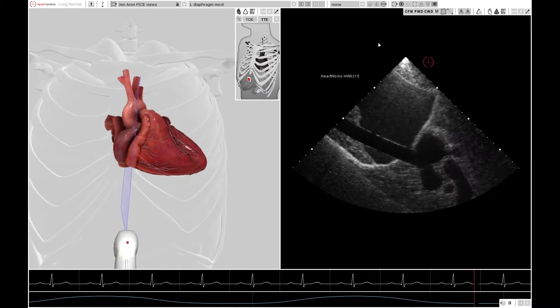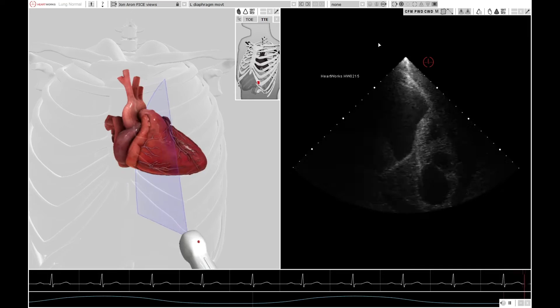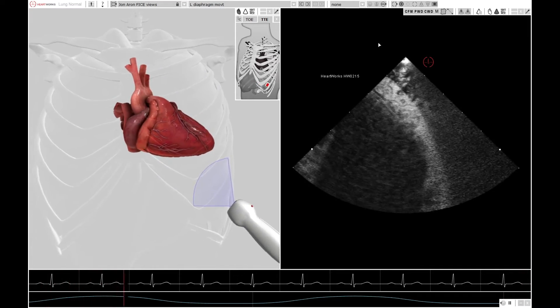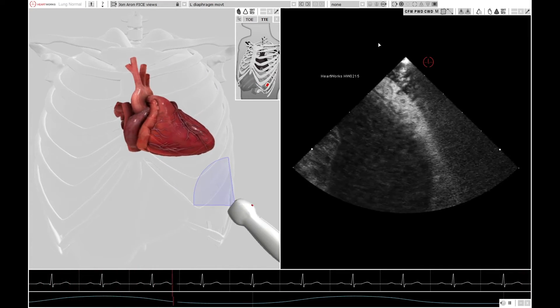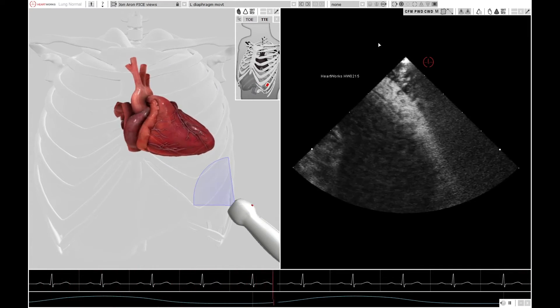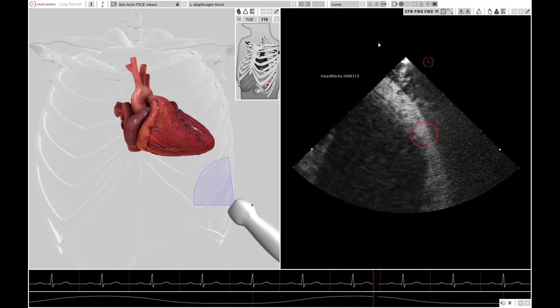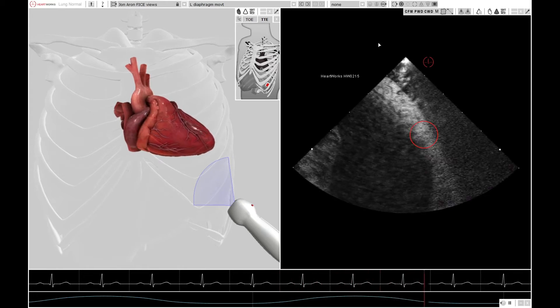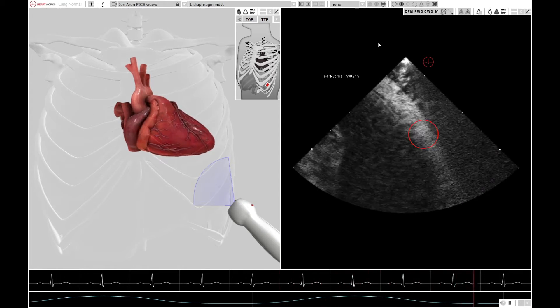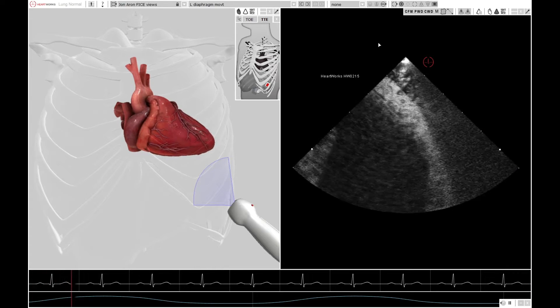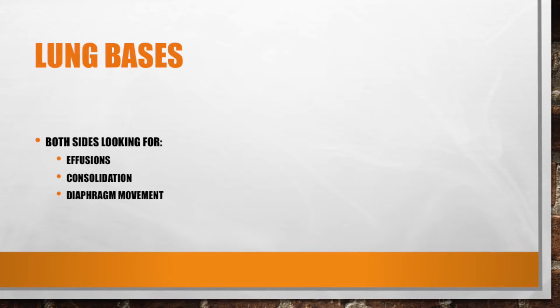Finally, to complete your scan, you image both lung bases looking for pleural effusions. You can also look for diaphragmatic movement, shown here, and sometimes you can even see lung consolidation — but that's another talk.